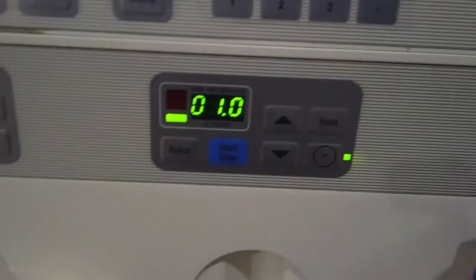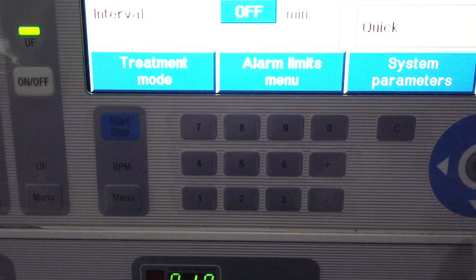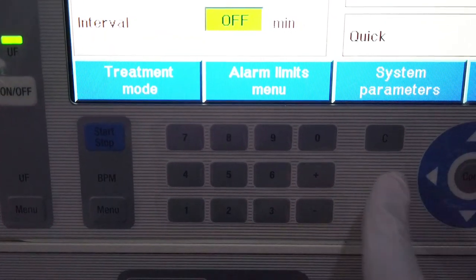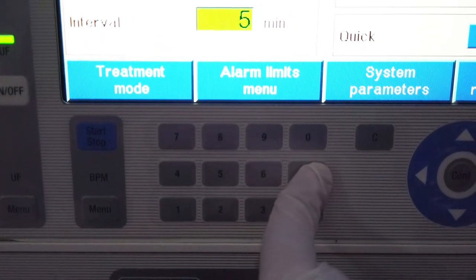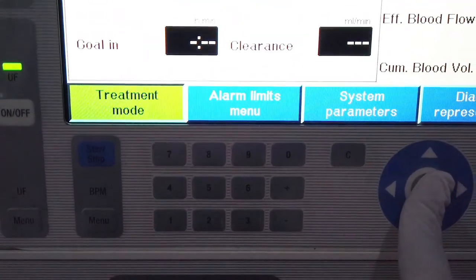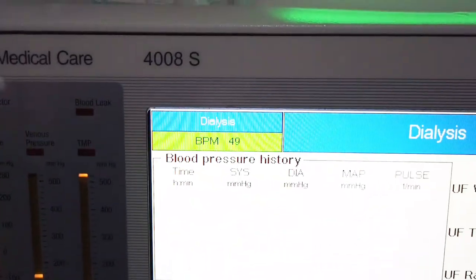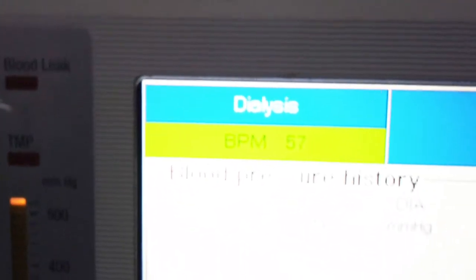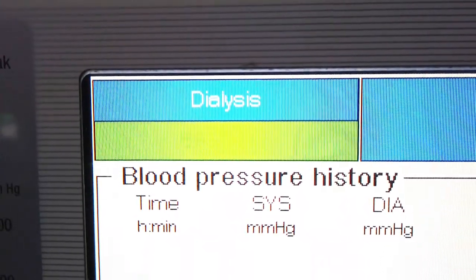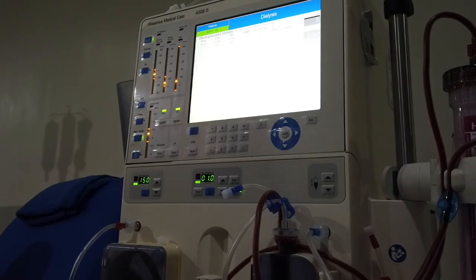Set blood pressure intervals by clicking the menu button. The box should be in green color to be able to set the value. Click the arrow buttons to go to the desired box, then click the plus and minus buttons to set the value — 30 minutes is my desired interval time. Click the confirm button once done, then click the start button to measure blood pressure. Note: the interval time should be set first before clicking start for it to work. Blood pressure will then be taken according to your set interval and will alarm if it exceeds below or beyond the set systolic and diastolic value.